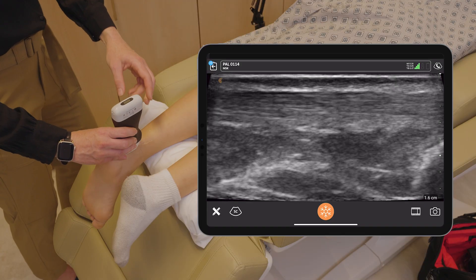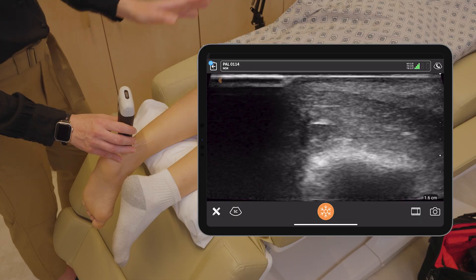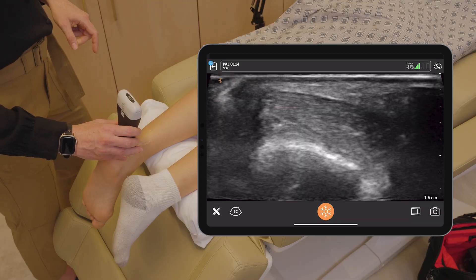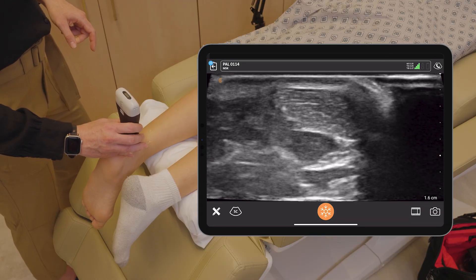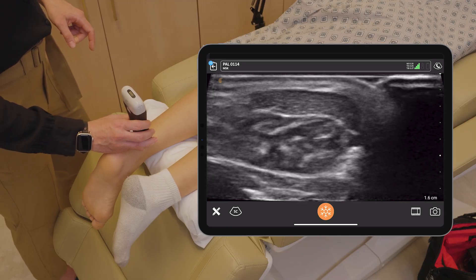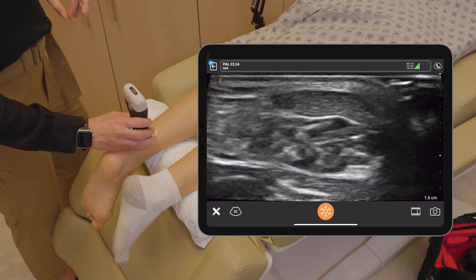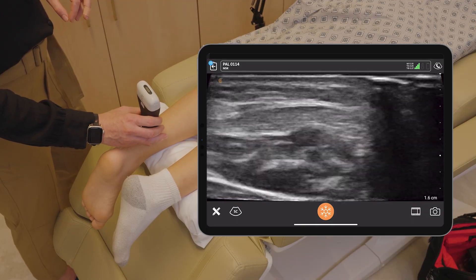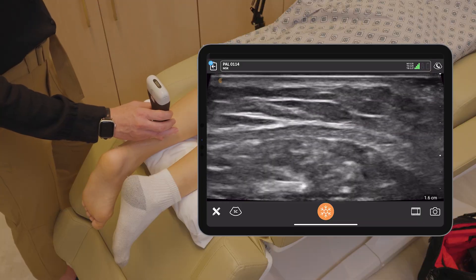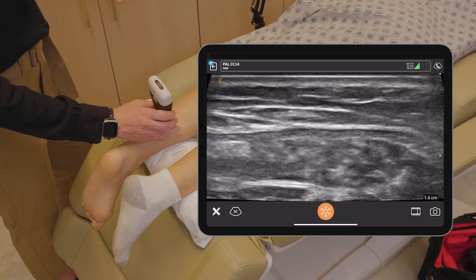I will also scan the Achilles tendon in a transverse orientation. I'm going to turn my probe 90 degrees with the probe marker pointing to the patient's left. This is the Achilles tendon in the center. We are seeing these punctate hyperechoic structures — this is a normal view. We are looking once again for anechoic areas or interruption and complete disruption of the tendon. You can see that the tendon flattens out as it becomes muscle.